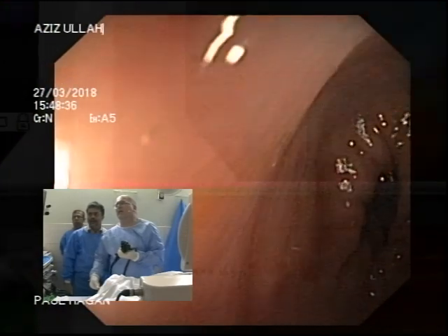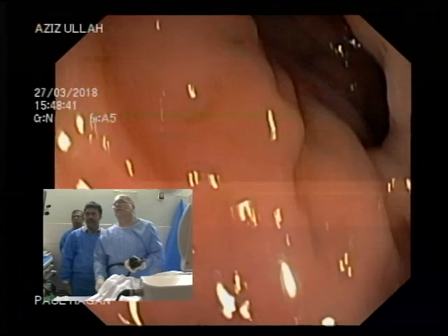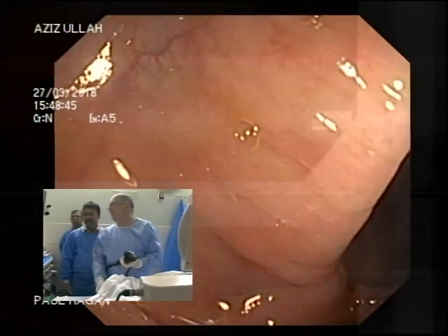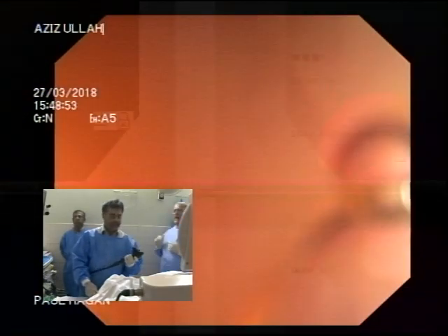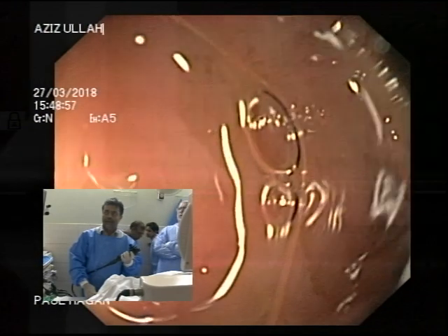Why is it opening for me? See it? So increase the clockwise torque. If it's stiff, you need more gel on the scope.